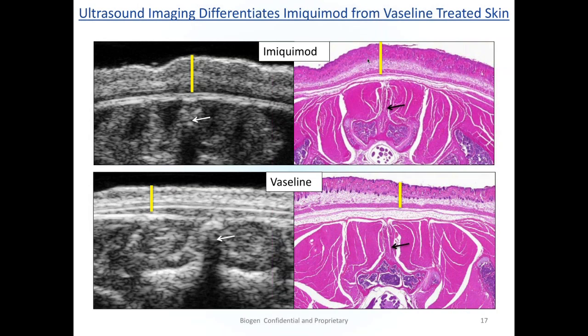Okay, thanks. A question here about vascular imaging, and I want to expand on it a little bit. There are different functional measurements that you can get, Doppler or using microbubble contrast for doing perfusion. Have you considered or used any of those methods?